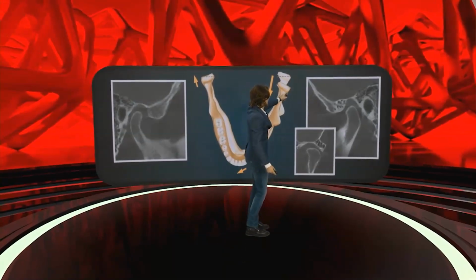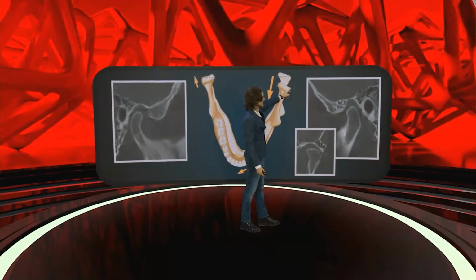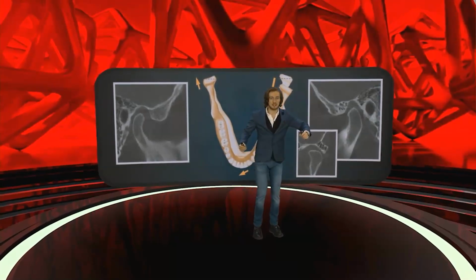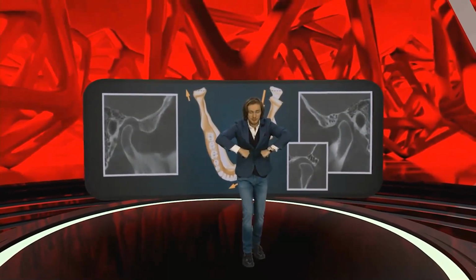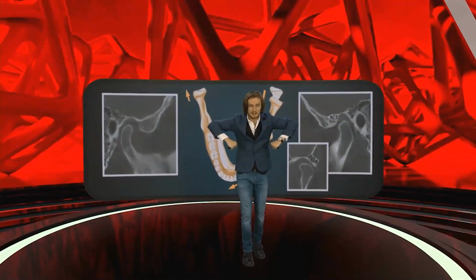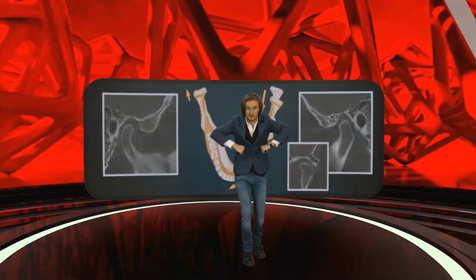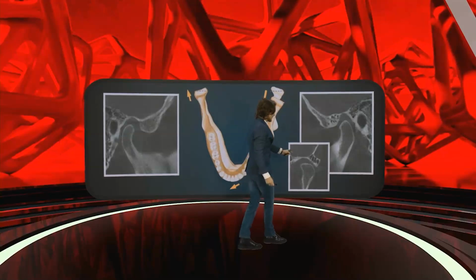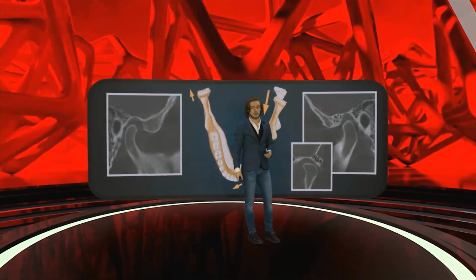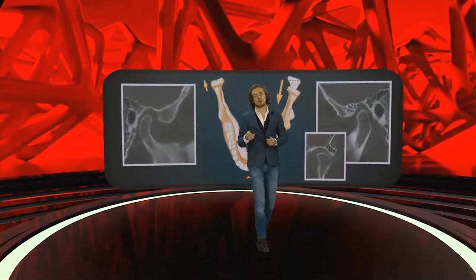That condyle, why do you see it too close to the temporal bone? Because this lateral pole is going outside. You remember that the jaw, when it's opening, the condyles are spreading, right? They are going much further from each other this way. Every time you go into the protrusion and every time you open, the condyles are going outside, so they are going closer to the temporal bone. On the other hand, that condyle is distalized, that you can clearly see on the CBCT.